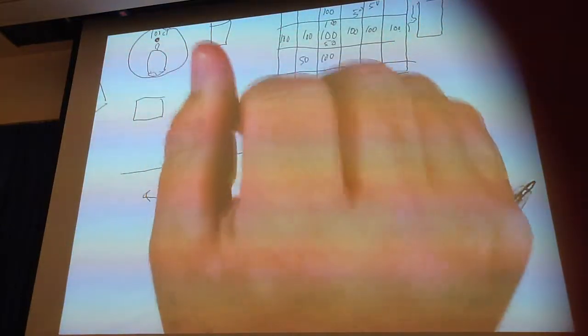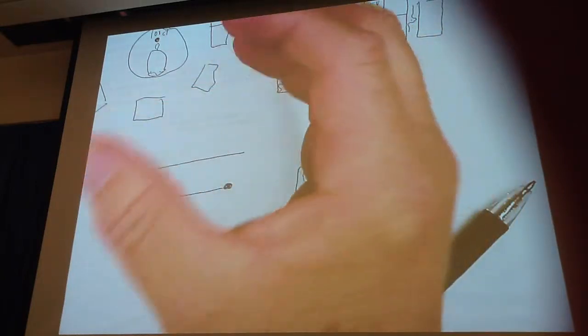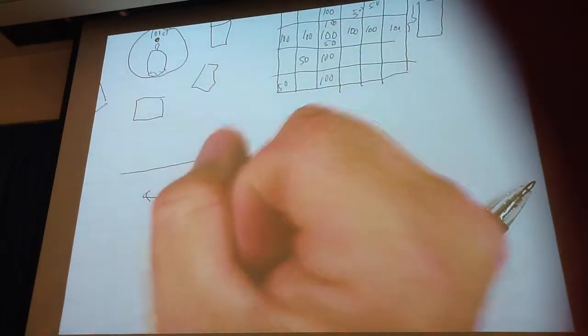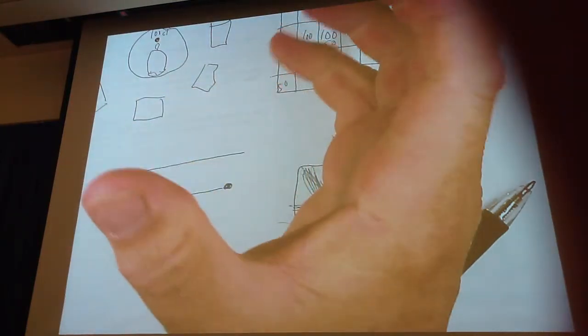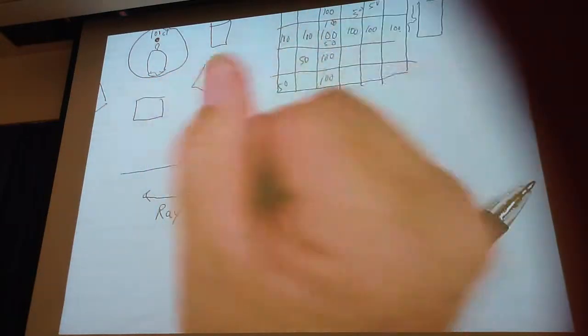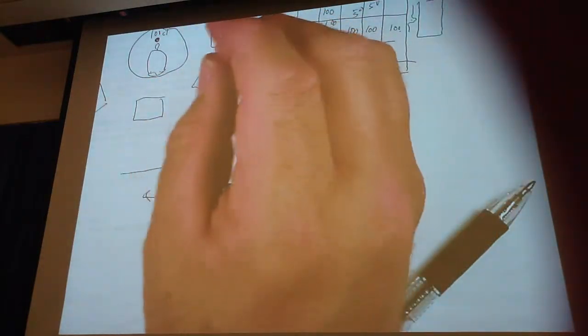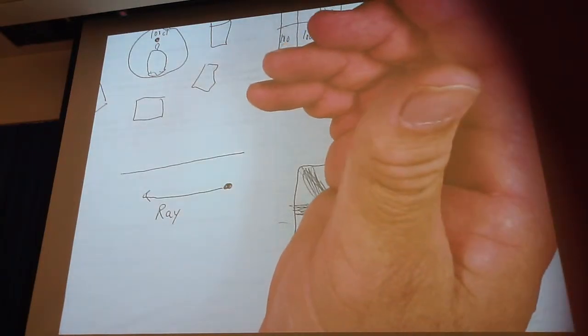Motion artifacts, right. So, by doing gated acquisition, here's my end diastole and here's my end systole. If I only take pictures of those two phases, I'm eliminating all this other motion in between. In the old days, before we started gating our acquisition, we basically had a moving picture.